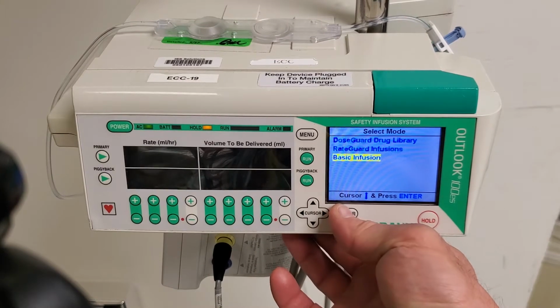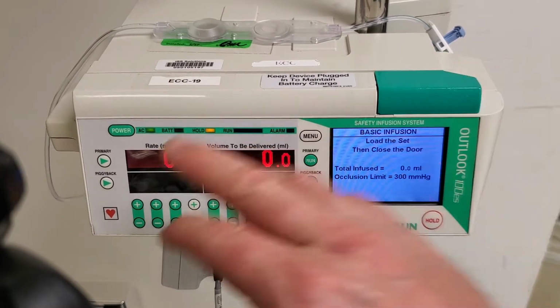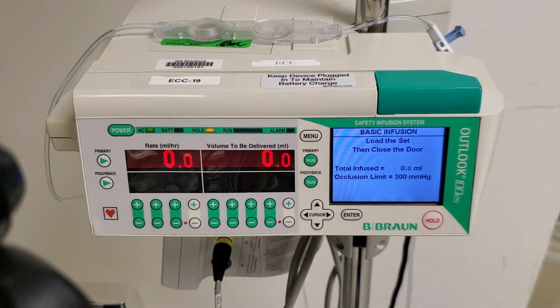In the basic infusion mode, all we do is set a rate and a volume to be delivered, and the pump goes. This is something that you'll use for maintenance fluids. If you're going to run a piggyback of an antibiotic, you'll also use this mode.